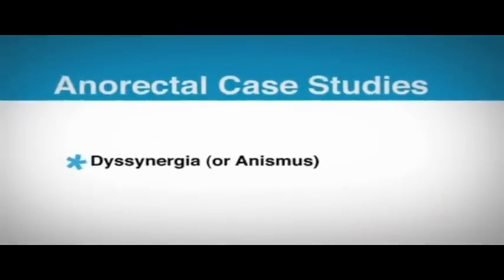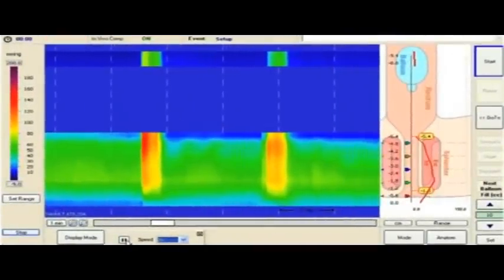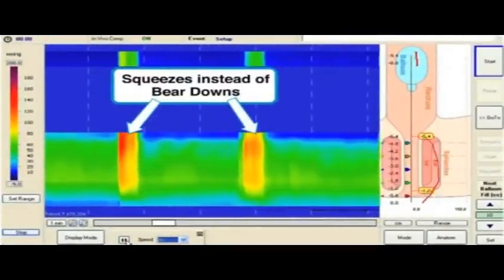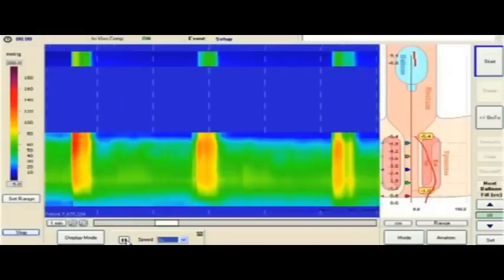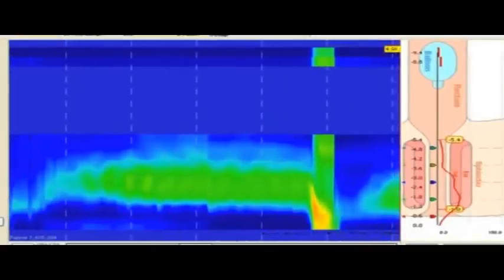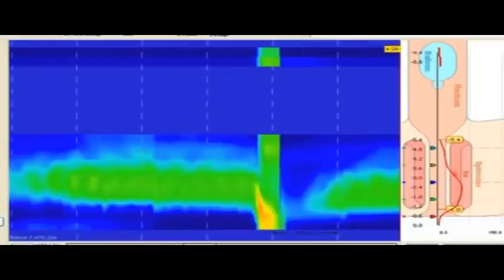Dysinergia, or anismus. In this case, when the patient is instructed to bear down, they squeeze instead. Additionally, rectal pressure is very high during these maneuvers. The difference is easily visualized when compared to a normal subject with appropriate bear down pressures.